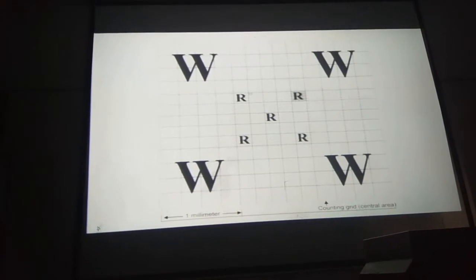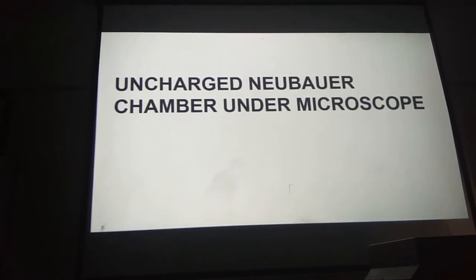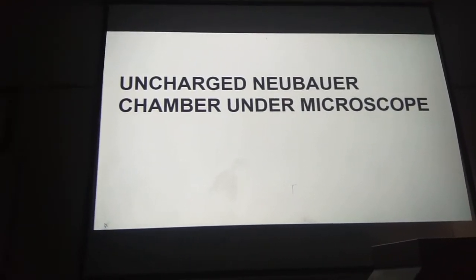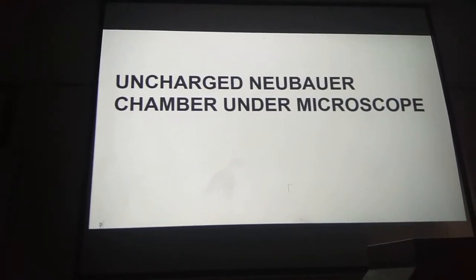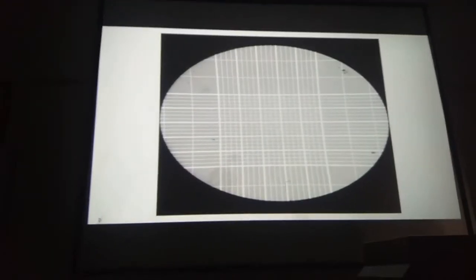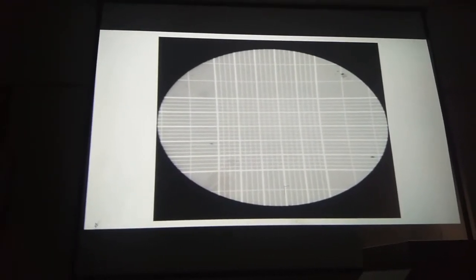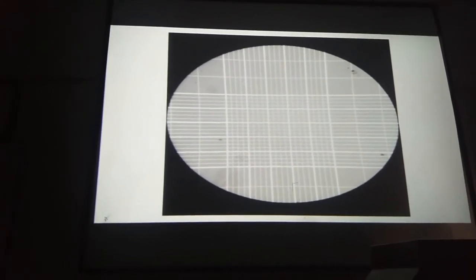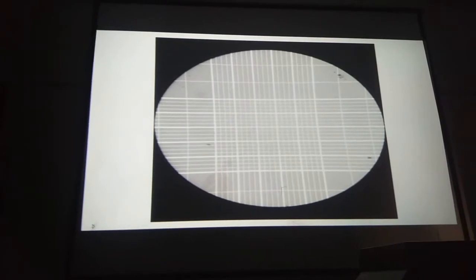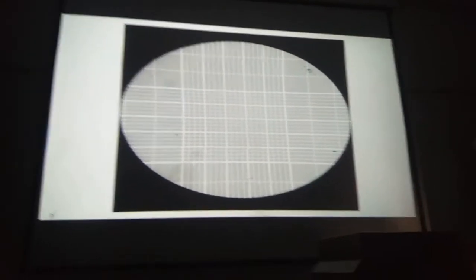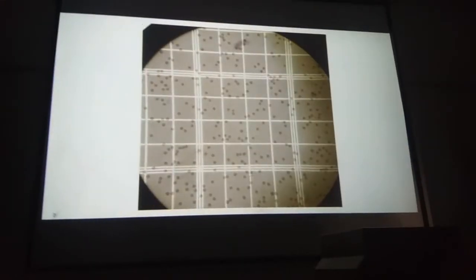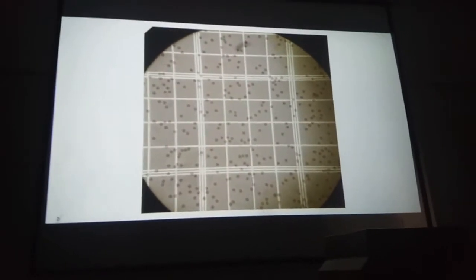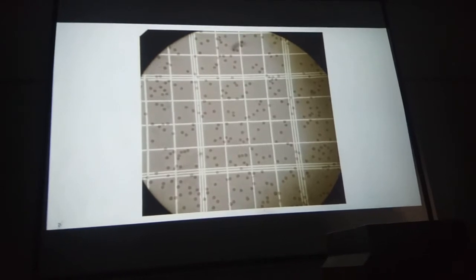Now I will show you how an uncharged Neubauer chamber appears under the microscope. This is how an uncharged Neubauer chamber appears when focused. After charging it with the mixture of Turk's fluid and blood, this is how the Neubauer chamber will appear — the cells are seen as small rounded dark dots.